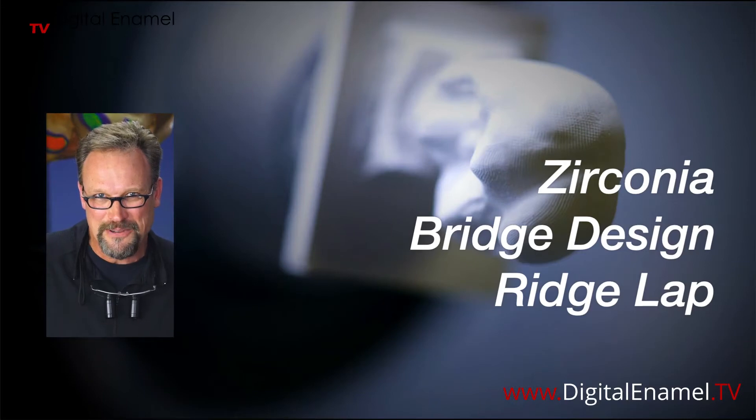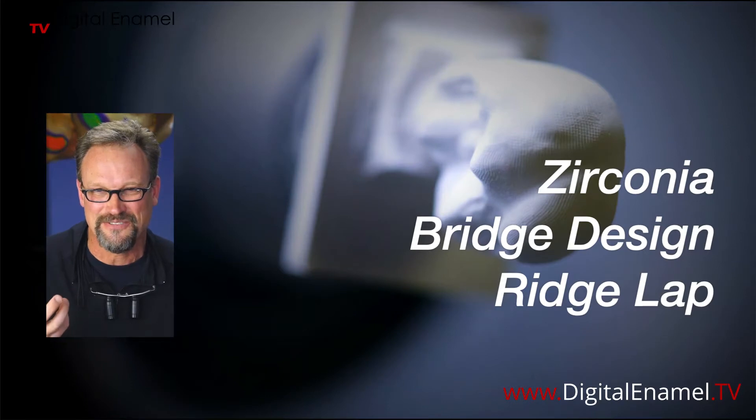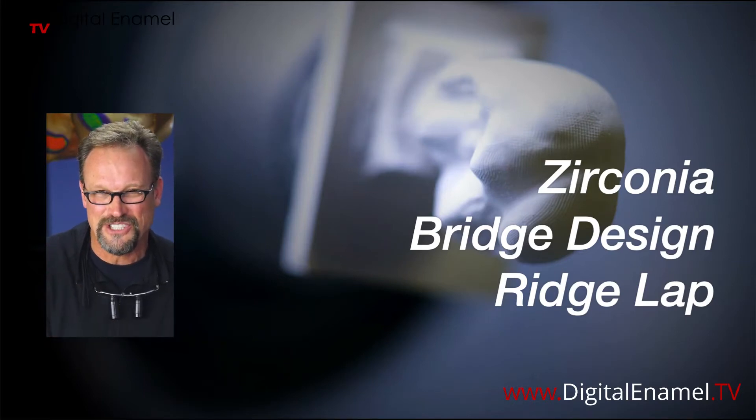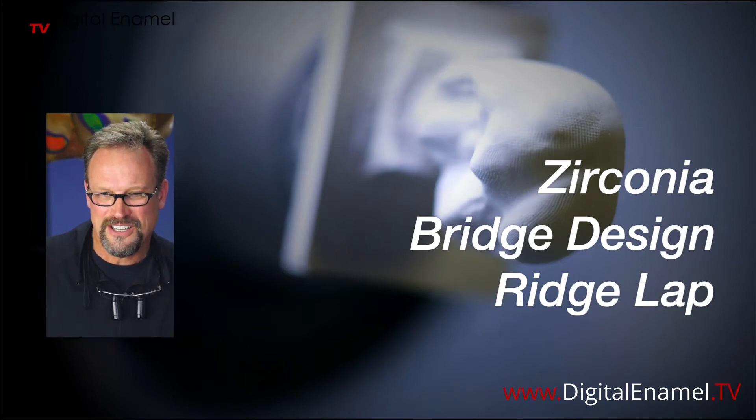That thing is the ridge lap. When you're making a bridge you're so worried about connector size and occlusion, but one of the things that actually looks really nice is if you get the ridge lap right — so it looks like the tooth is coming out of the gingiva. I'll give you a quick little trick on how to do this, and if you have any questions along the way just give me a shout out.